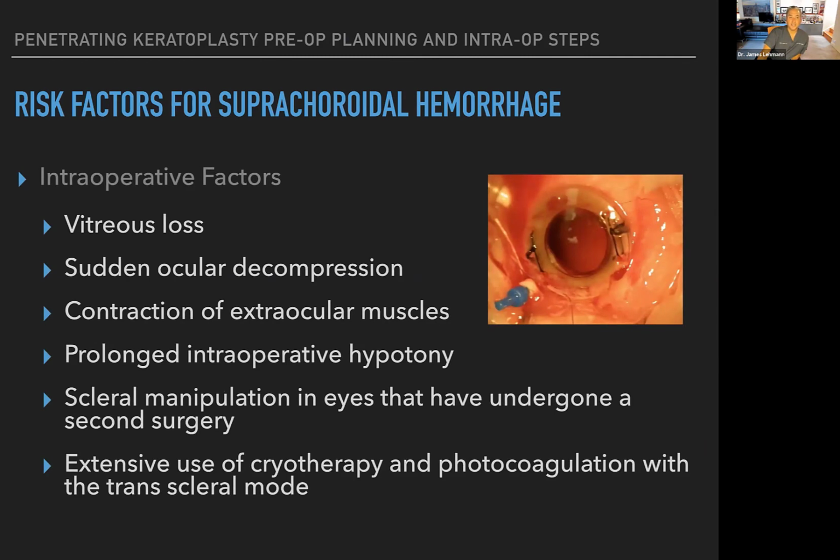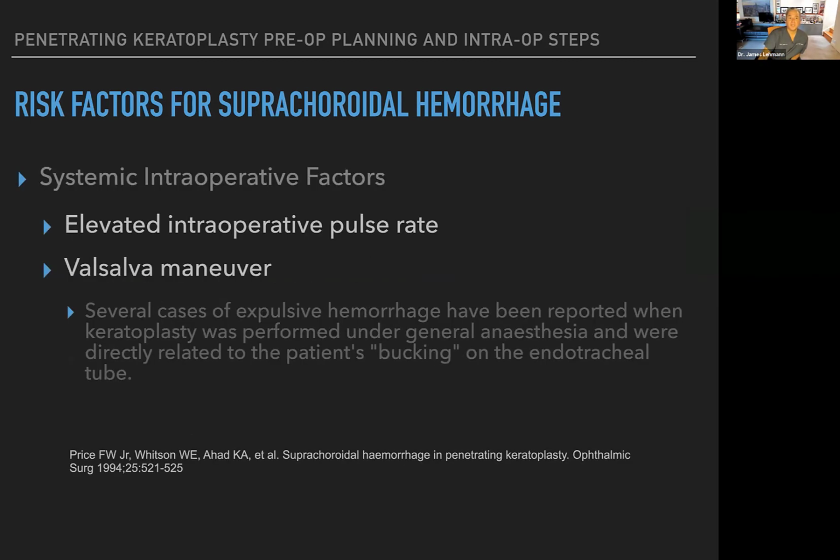And how about during the surgery? What increases the risk? Well, vitreous loss, sudden ocular decompression, like when you do the trephination, or pain. So if you're hurting the patient, they don't have complete anesthesia, then they start squeezing. Like I said, elevated intraoperative pulse rate, Valsalva. We don't want them to be bucking, right? The bucking means Valsalva.